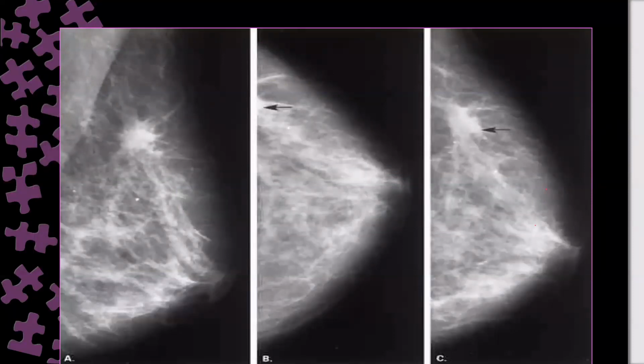And this one, Sumaya, that is for you. Tell me just which view. It is obvious. Sumaya, are you with me? What is this view? Mediolateral oblique. Mediolateral or mediolateral oblique? Oh yes, a complete mediolateral oblique view. Excellent. It demonstrates a suspicious spiculated high density mass here.